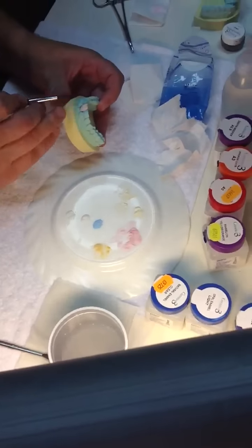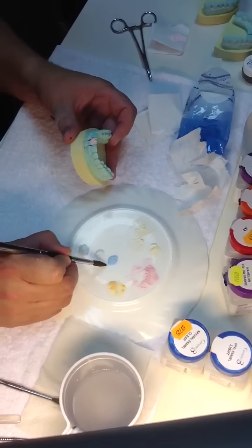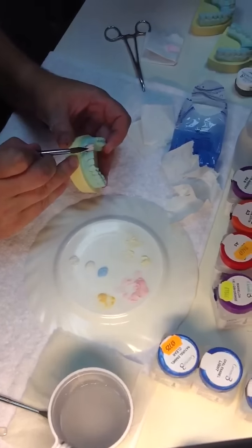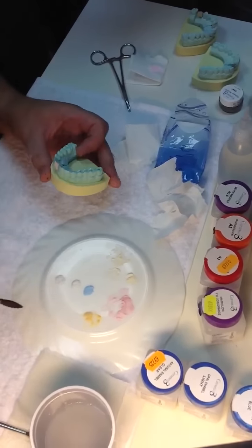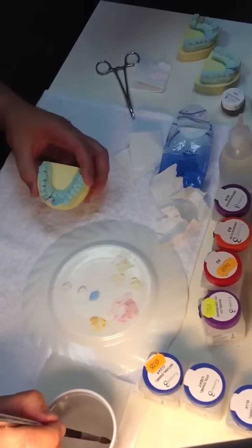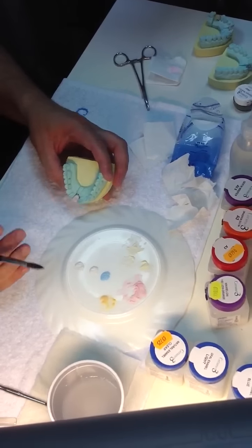Now it's quite dry in here. You can see the porcelain has dried. Try not to put wet porcelain directly onto dried. So if the crown has sat for a little while, or it's really dried out, or the bridge is really dried out, always rehydrate the porcelain first. If your crown has dried out, better add moisture.